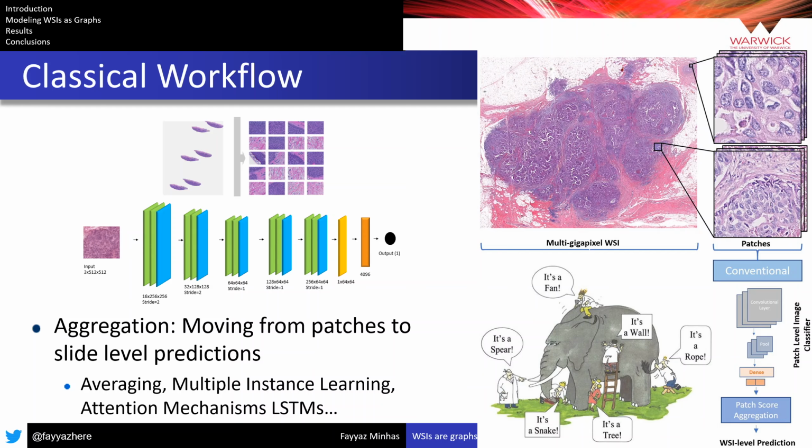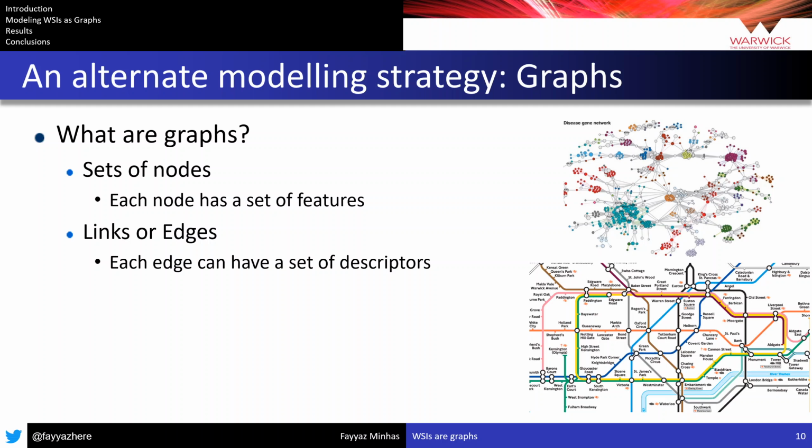These challenges required the development of a specialized type of representation for a given whole slide image. And what we propose is that graphs are a natural way of modeling whole slide images. How is that the case? We'll talk about that in just a minute. But before moving there, let me introduce what graphs are.